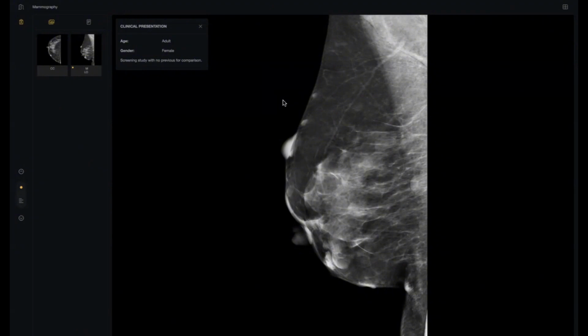I will inform the findings to the referring physician and also suggest ultrasound correlation and a systemic review to rule out any history of workup for neurofibromas. Also, ultrasound correlation will be helpful in this case.